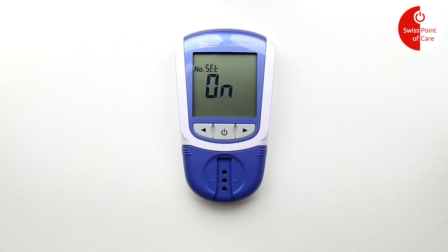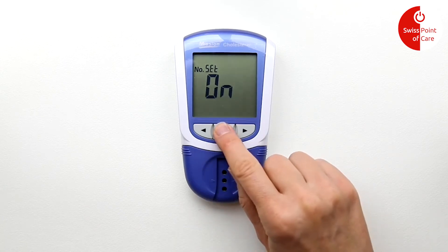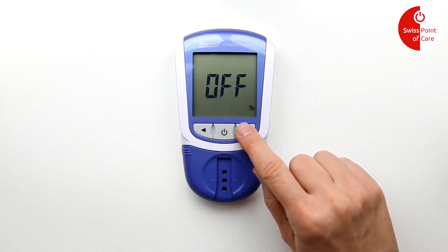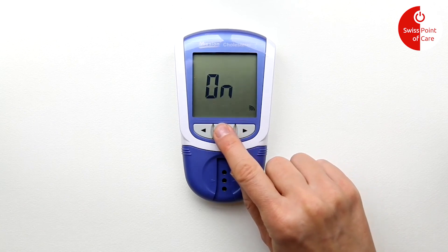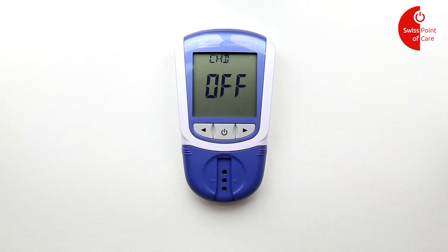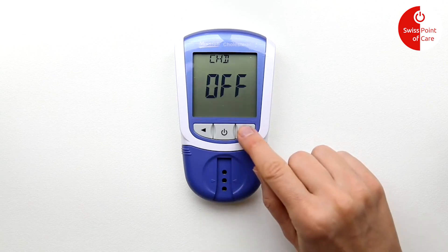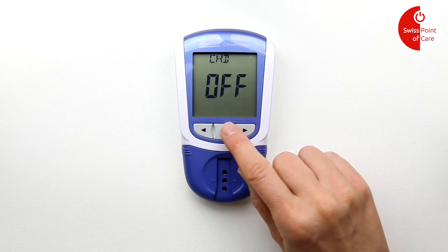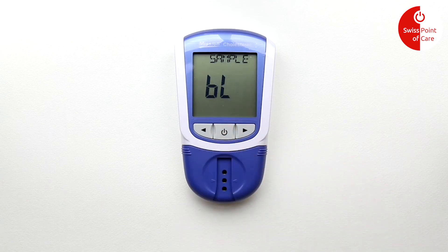Press the power button again to confirm. Use the arrows to turn the sound on or off, and confirm this with the on/off button. Use the arrows to select CHO off. Press the power button to save and use the arrows to select sample type: blood.